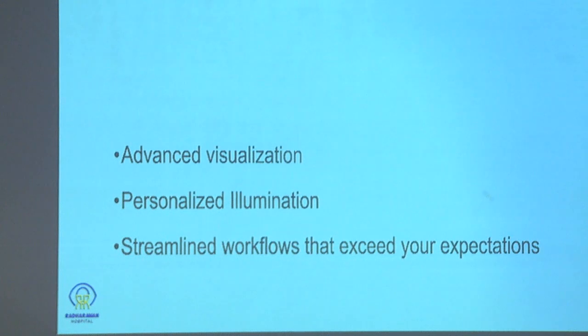It has a depth perception of 65 millimeters. So the buffer zone is 65. A lot of times using the foot switch, we have to fine focus on the eye, to focus on different structures, from the cornea to the anterior capsule to the posterior capsule if need be. Since it gives you a buffer of 65 millimeters, even if you are focused on the cornea, you can clearly see the posterior capsule. So that extra effort of adjusting the fine focus is not there. These are very little things, very little niches, which actually reduce the surgical time a lot.